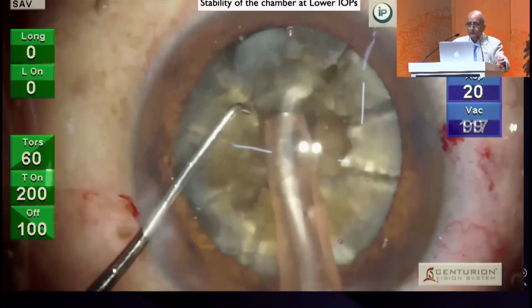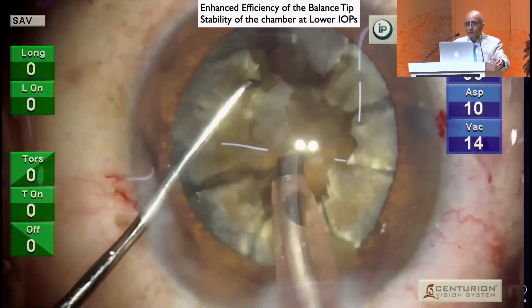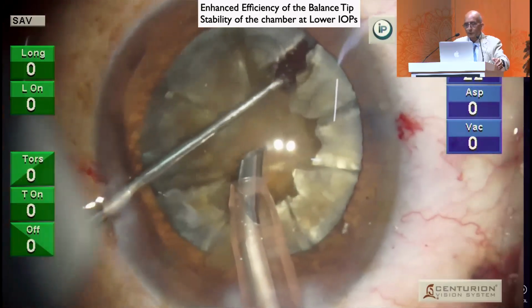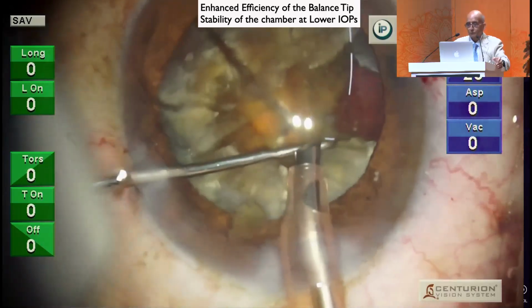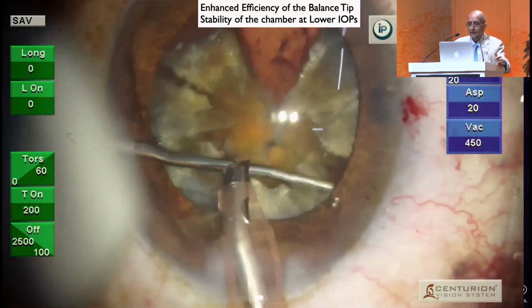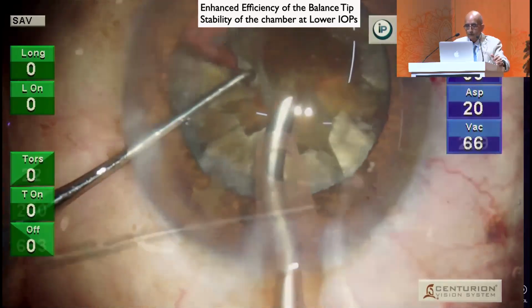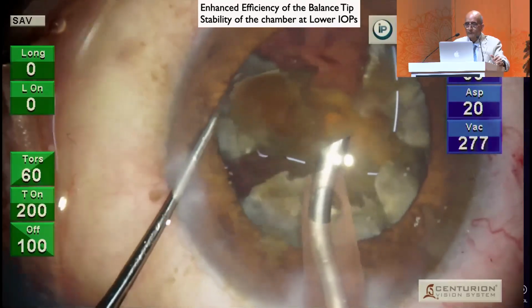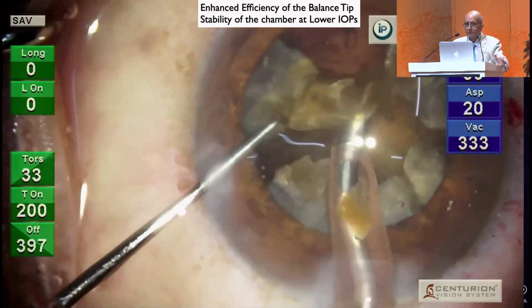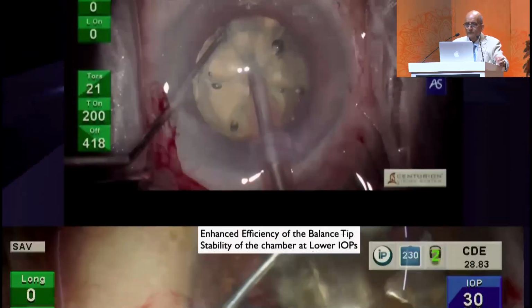And repeated use of dispersive viscoelastic containing chondroitin sulfate is really very useful and very protective to assure a clear cornea on day 1. We had a rule, 1 minute of clock time or 2 minutes depending upon the endothelial health. I would be given a Viscoat or a chondroitin sulfate in my hand, and we'll keep injecting the viscoelastic every 2 or 3 fragments. But notice the low IOP, low flow rate, and even with this low flow rate, 20, it comes up very well. So this is what I meant. Keep injecting Viscoat and continue doing that.